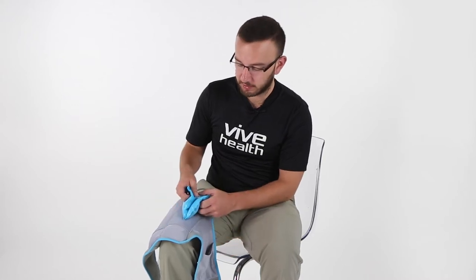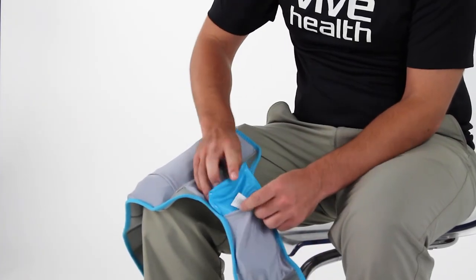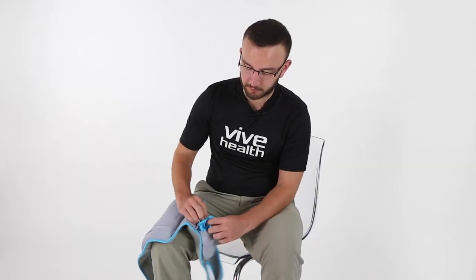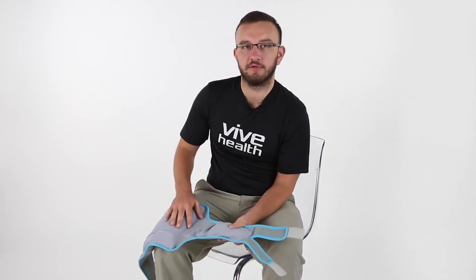All the ice packs are silicon gel, so they're flexible and frozen, as well as great for heat therapy or ice therapy. It's really easy to remove them and put them back into the pockets just like this, so you don't have to freeze the whole brace when you're going to make it cold, so it makes a lot less storage for you and a lot easier to use.